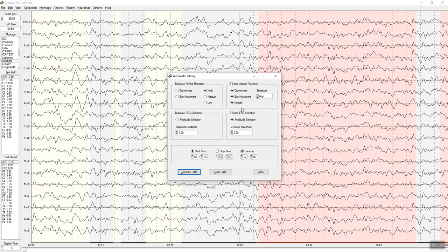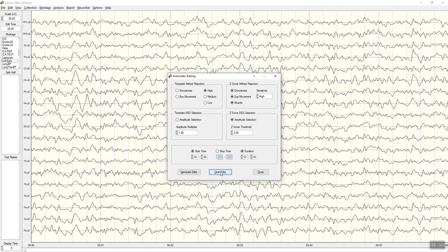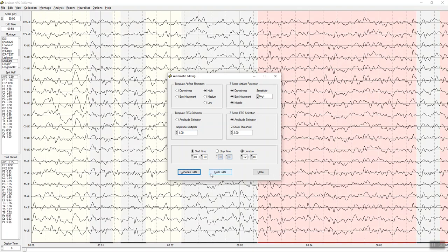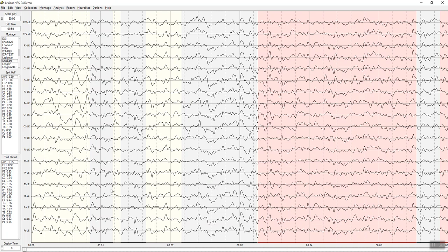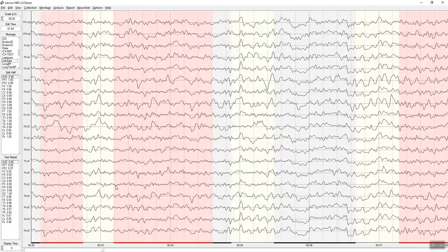There's automatic deletion of drowsiness, eye movement artifact and muscle. If that doesn't work for whatever reason, you can create a 10-second template and then use that. All of this has been covered in detail in other videos. I'm going to just quickly clear and then show how fast that is to create now one minute and 59 seconds of EEG, which you can then use the keys to scan down on and to page up and page down.